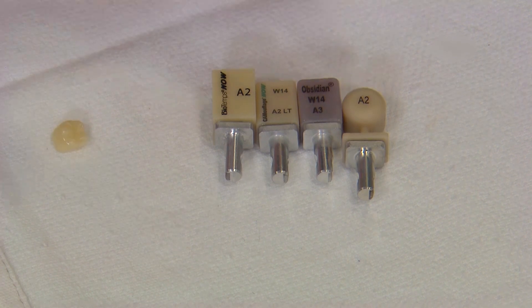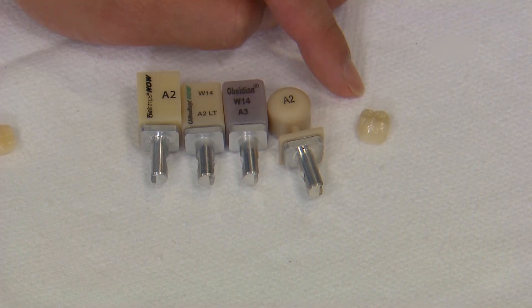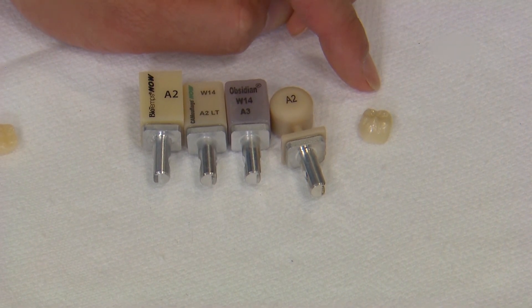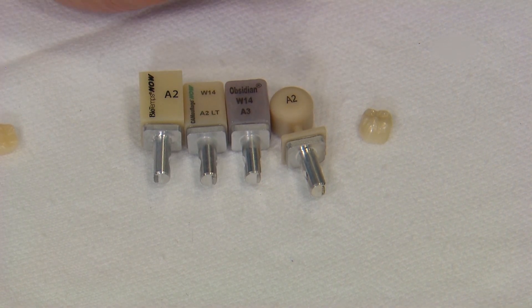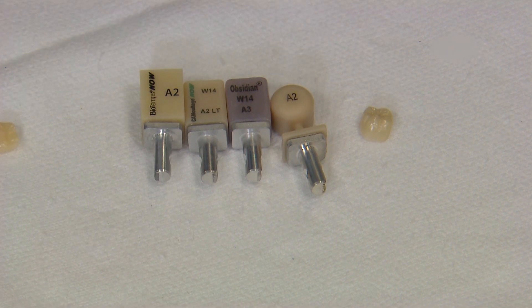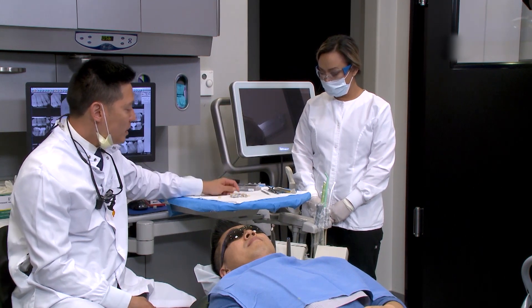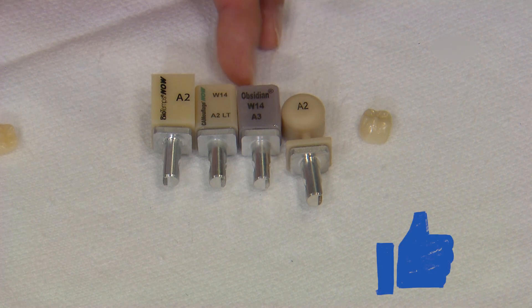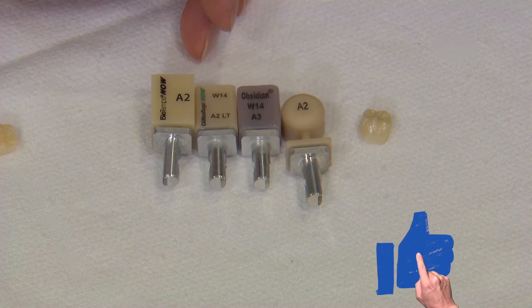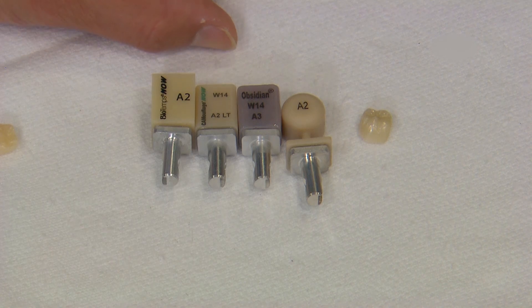Right out of the oven — here we have our polished zirconia crown done earlier — it's ready to cement. Because of its high-strength nature, you can use a conventional cement like Relyx Luting Plus, 3M's resin-modified glass ionomer, or Ceramir. You can use whatever you normally like and it works very well, but there is also an option to bond it in. Obsidian, depending on the size of the restoration, takes about 12 to 15 minutes to mill. Camouflage is usually less than 10 minutes because of the resin content, and Bio Temps is also less than 10 minutes if you want to mill a quick provisional.